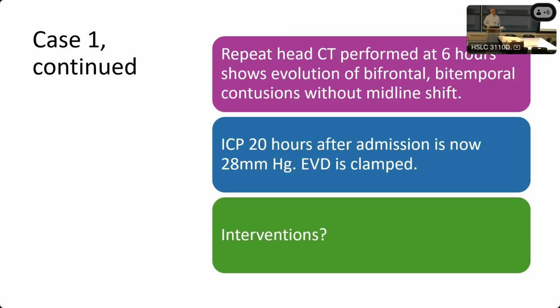So functionally, when it's clamped, it's just pressure monitored. You may want to also make sure that they have it set properly. How are they supposed to set these? Make sure that it's calibrated correctly, that it's an accurate reading based on the setup.